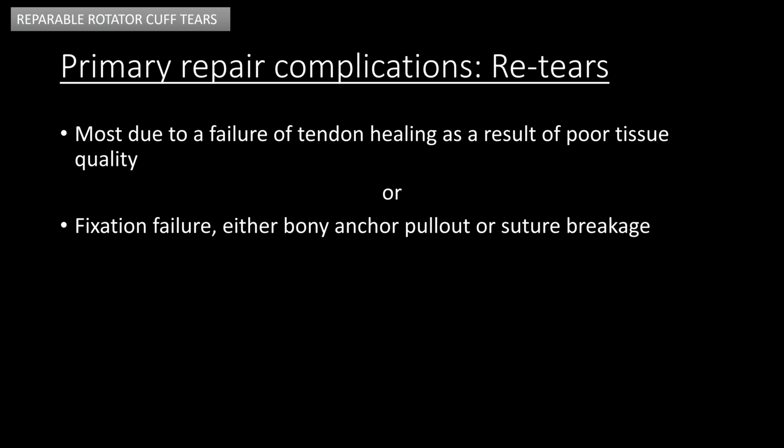In addition to failure of the tendon healing, the second most common reason for re-tear is the fixation failure, which could be either in the bony anchor pullout or suture breakage.